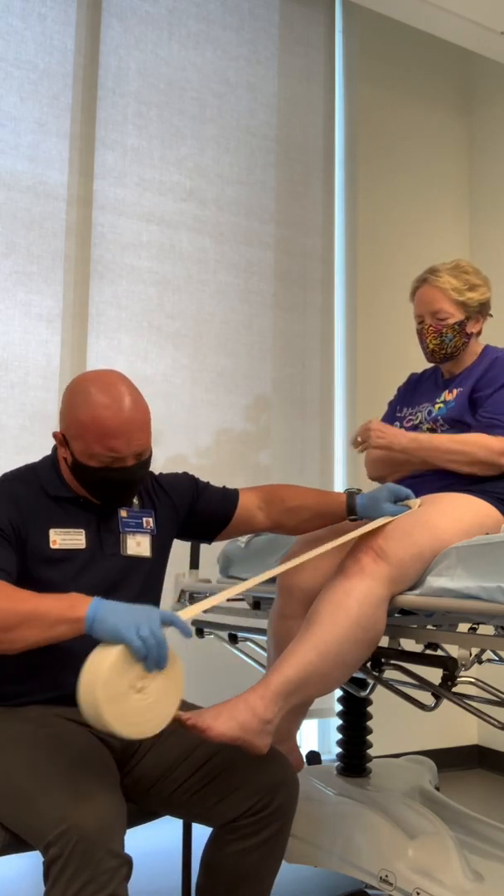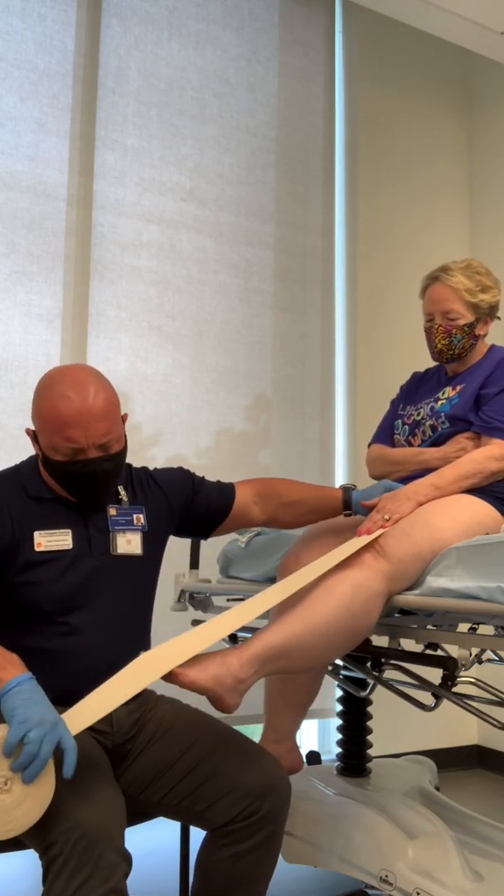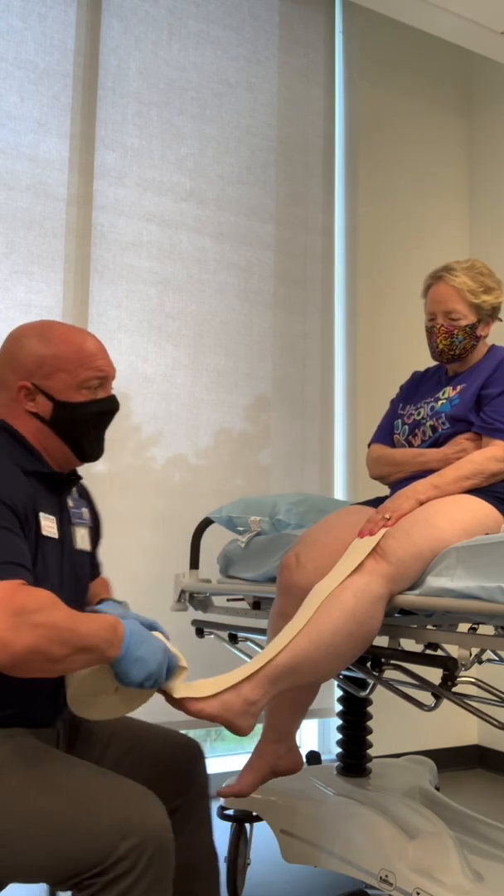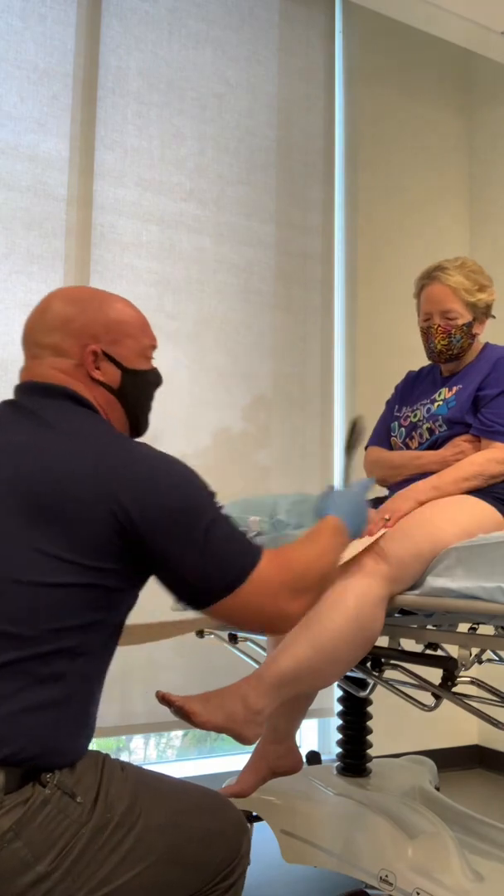I'm going to go from about mid-thigh, about one hand's length past the toes. And from that point, we're just going to simply cut.